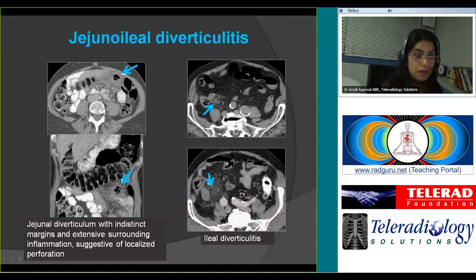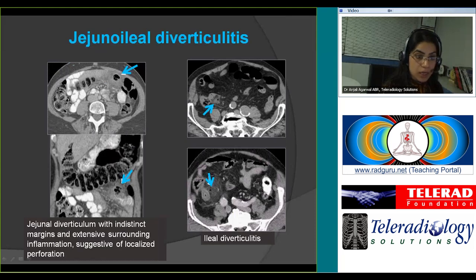Some examples of small bowel diverticulitis: this is an inflamed jejunal diverticulum with indistinct margins, extensive surrounding fat stranding and inflammation suggesting localized perforation, better seen on coronal reformatted images. Another case of ileal diverticulitis with microperforation — a tiny diverticulum; in this case, the appendix was normal.